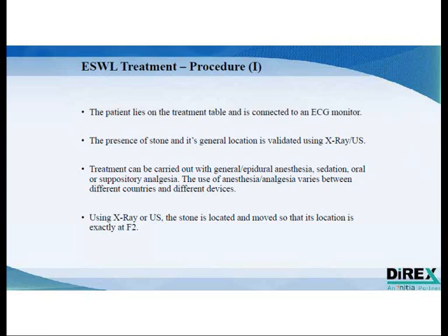The stone is then located using X-ray, ultrasound, or both, and the treatment is usually carried out, but this depends on the region in the world, using anesthesia or analgesics. Some countries will choose to bring in their patient fully asleep, and some countries will just administer analgesics.